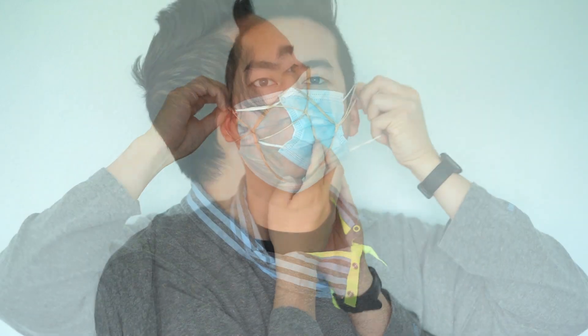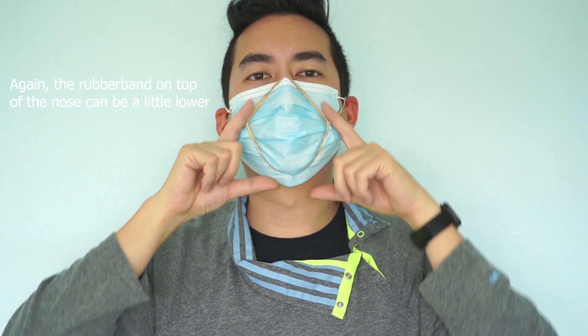Different rubber bands have different strength and elasticity, so this one is looser for your ears. Now the seal is a lot tighter around your mouth, similar to an N95, where it's tight around your face so that you're able to not breathe out through the sides.